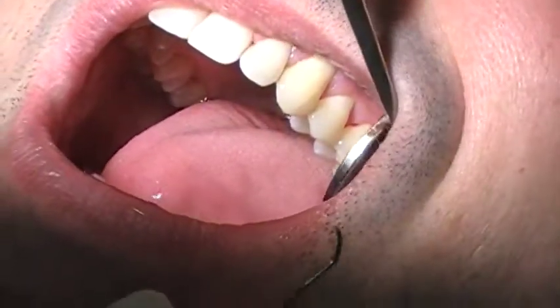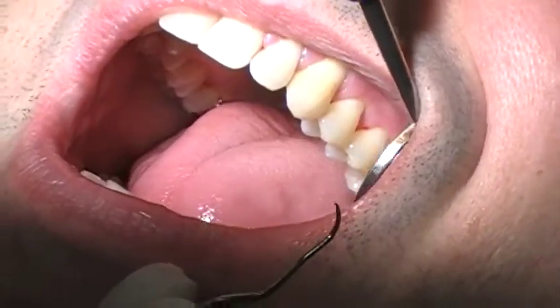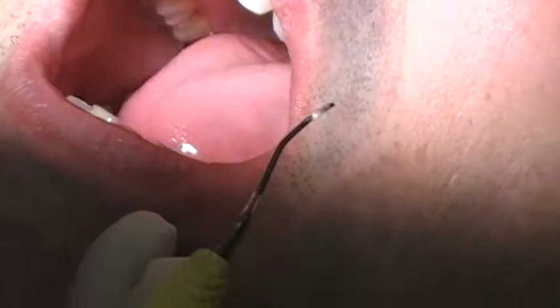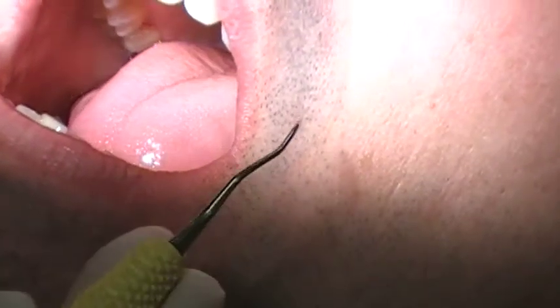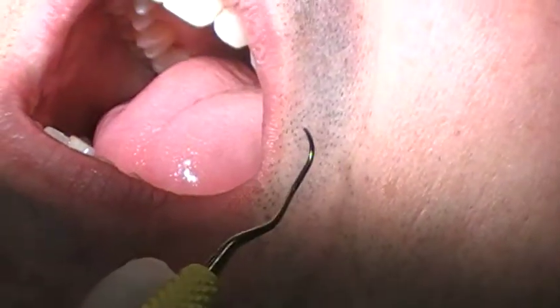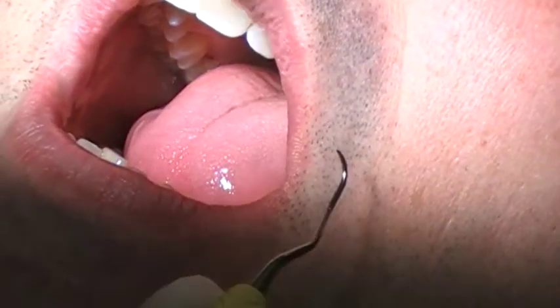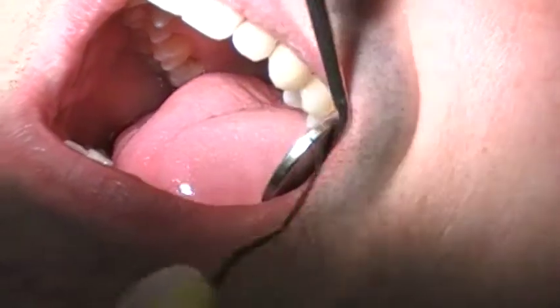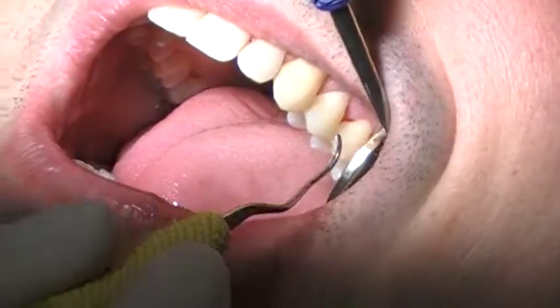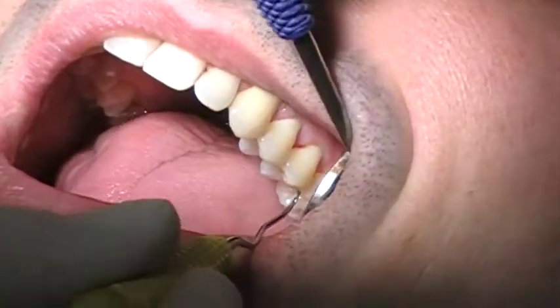The next instrument I'm going to use in quadrant two is the 11-12 instrument. This is a Gracey of the Gracey series, and it's an instrument that is used on the posteriors, and you want to use it on the mesial surfaces.